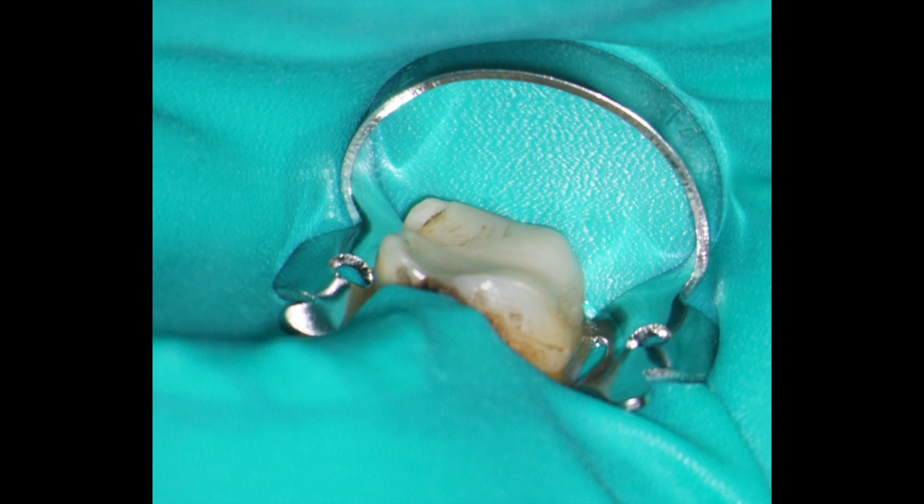I'll start access cavity preparation in the centre of this dip using a long tapered diamond burr and a round burr, and then I'll work progressively sideways until I've lifted off the roof of the pulp chamber.